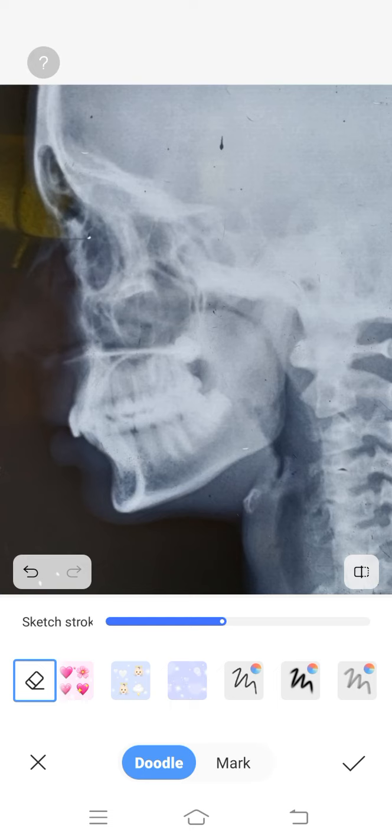Care should be taken not to confuse juvenile nasopharyngeal angiofibroma, in which case the mass would be a pinkish, fleshy mass in the posterior part of the nasal cavity, and it can extend into the nasopharynx and also oropharynx. CT scan may show extension into the pterygopalatine fossa and infratemporal fossa, and this would be contrast enhancing also.